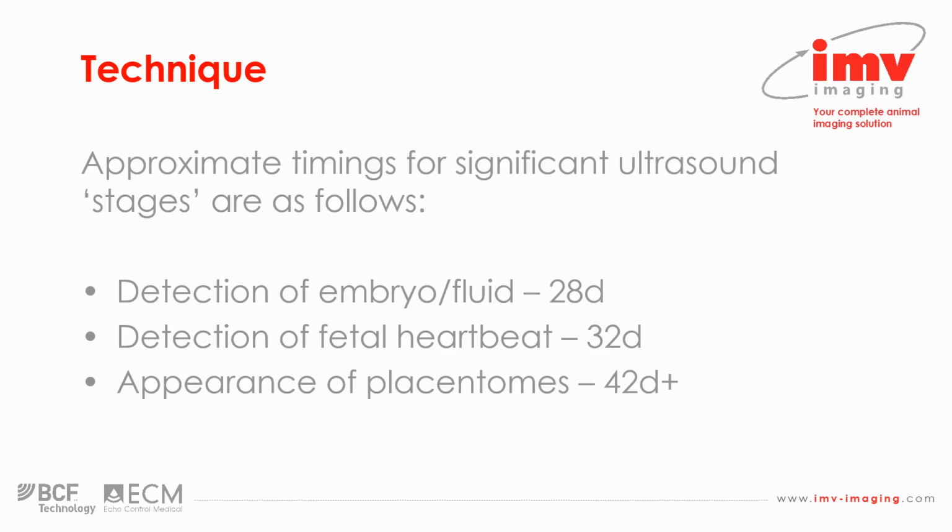and because of potential variability of exact insemination dates, or conception dates I should say, I would tend to err towards scanning around 32 days onwards. That way you're able to assess the fetal heartbeat reliably when you perform the first examination.